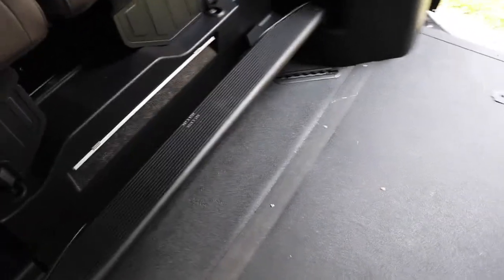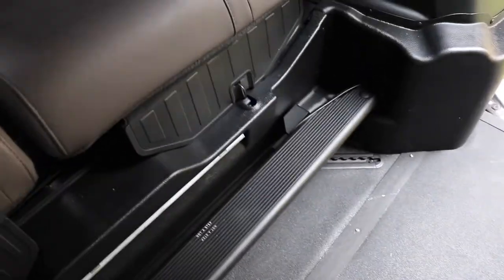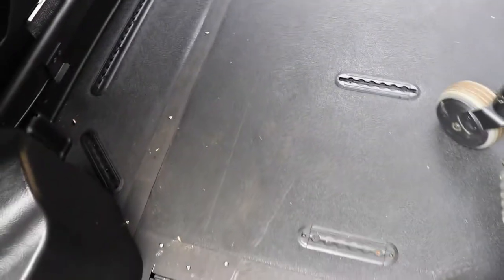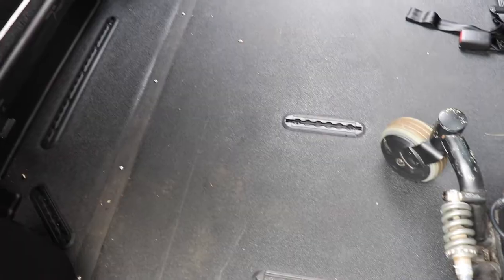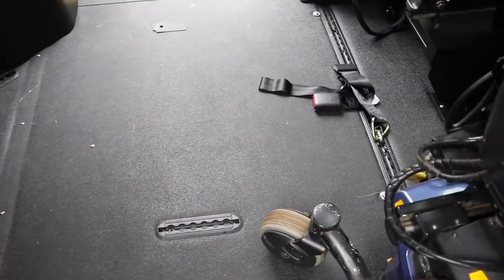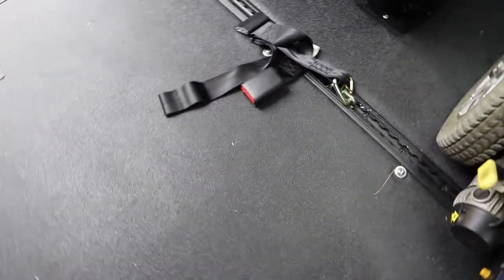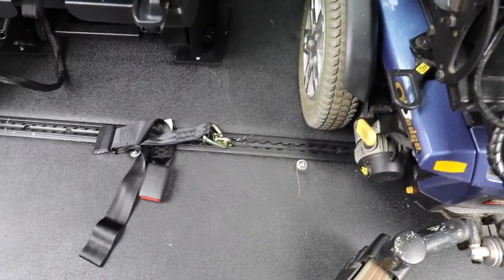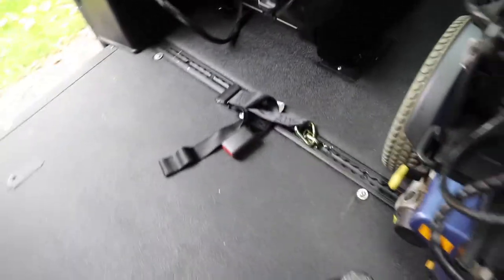It gives clearance for Anna when she gets in and out — she needs that space. Down here is where the strapping system was when she had it. And there's her seat belt for the front seat — it goes inside the floor.